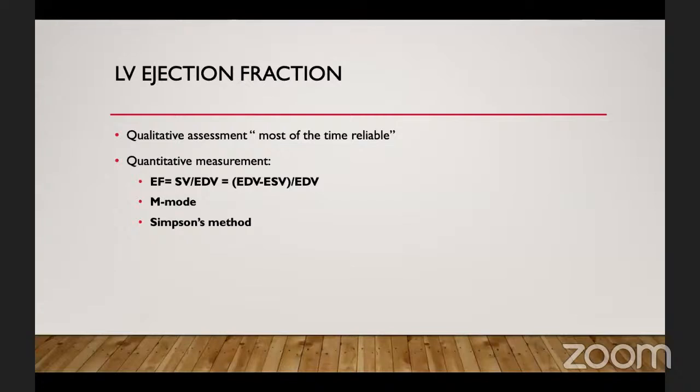The ejection fraction, most of the time you find an expert echocardiographer gives you a qualitative assessment, and most of the time it is actually reliable. But specifically in patients in whom you want to follow up regularly and to see the progression or deterioration of their condition, you have to have quantitative measures. And to have quantitative measures, you do the assessment of ejection fraction.